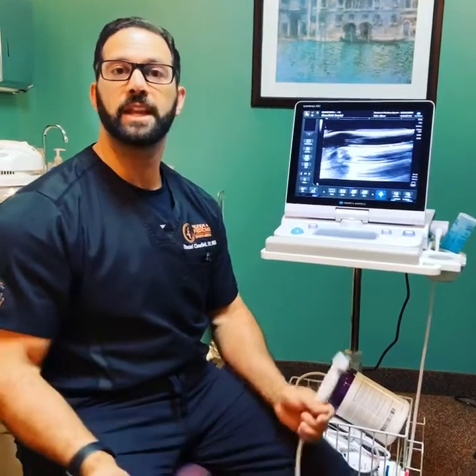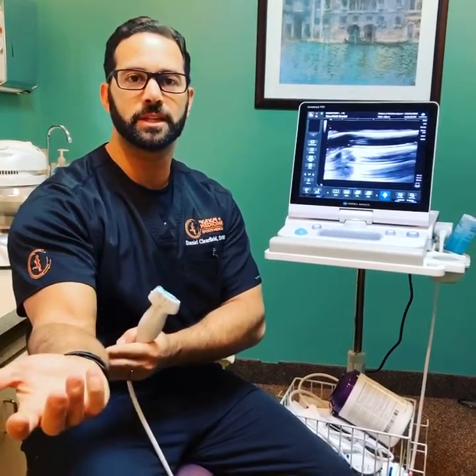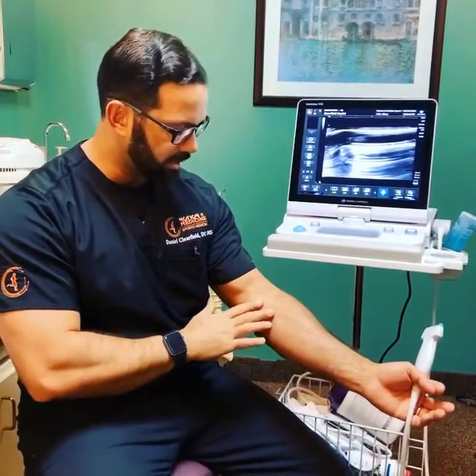Hey, Dr. C here. Today's the day. I'm going to be doing PRP on myself for my chronic medial epicondylitis, more accurately epicondylosis. I've already done my blood draw, got some blood out of me, spun it down, and we have our PRP product ready.